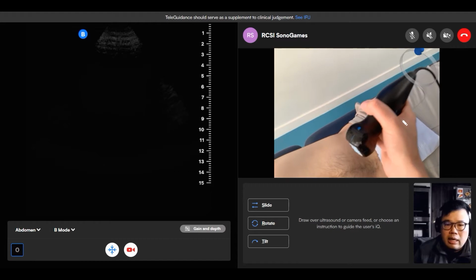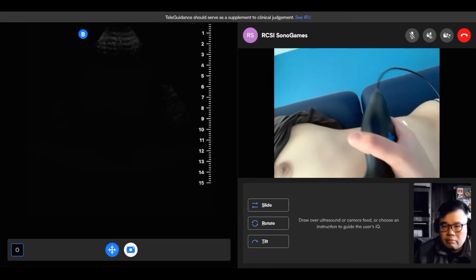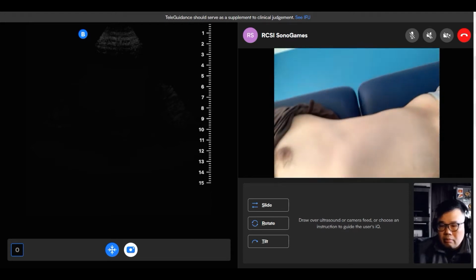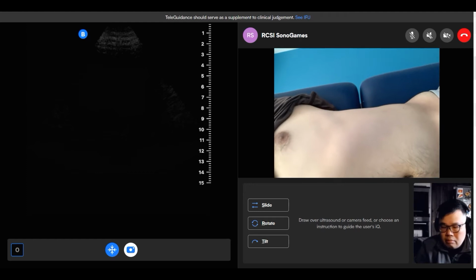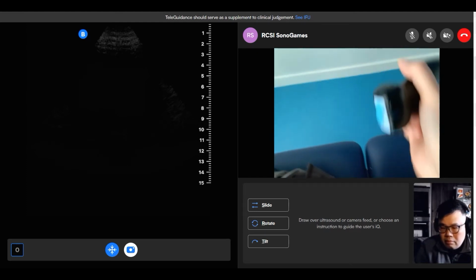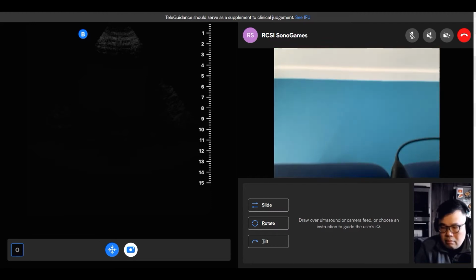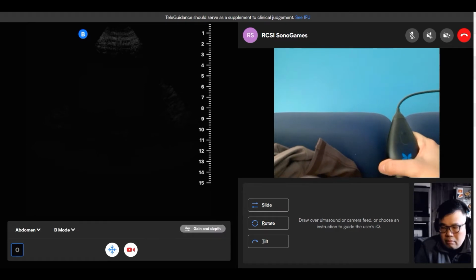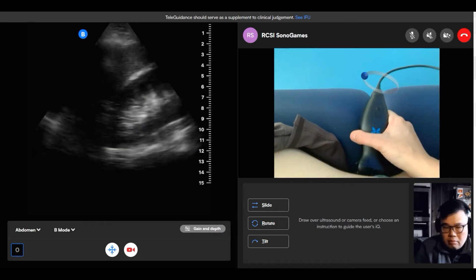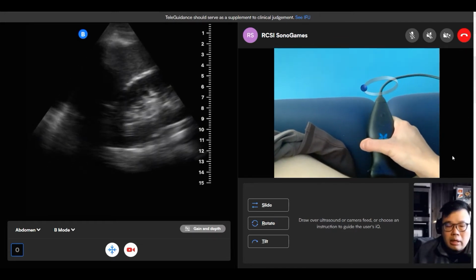Okay, so left upper quadrant if you like. Yep. Just put a little bit more gel. Alright, put that near your head. Alright, so probe to the table is what I remember about this. Yeah, you're good. Okay, good view.